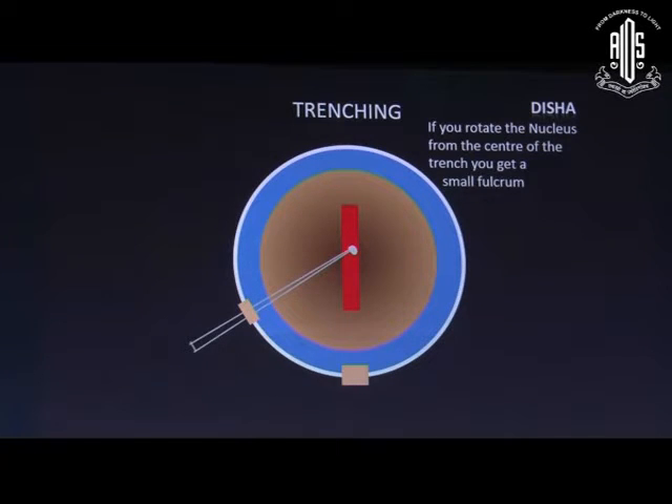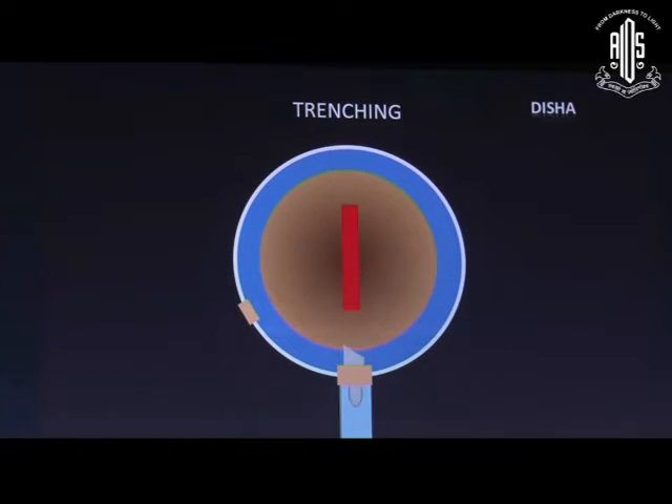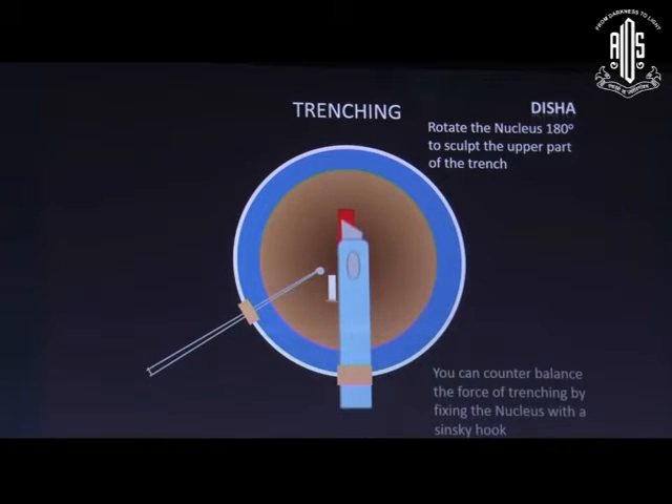To rotate the nucleus, if we push from the center of the trench we get a very short lever arm, making rotation difficult. But if we rotate from the end or periphery of the tunnel we get a bigger lever arm and rotation will be easier. When one side of the trenching is complete, rotate the nucleus 180 degrees to sculpt the upper part of the trench. We can use a Sinski hook to counterbalance the force of trenching.